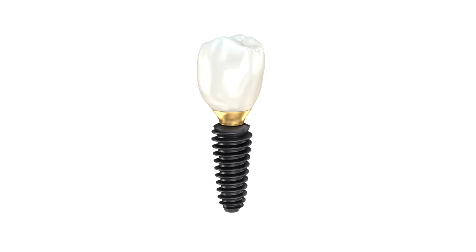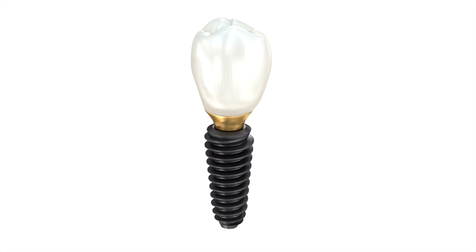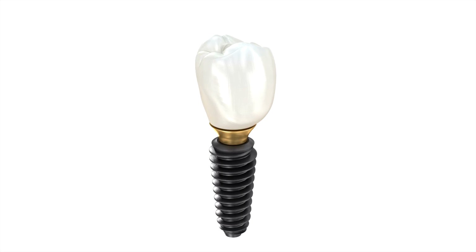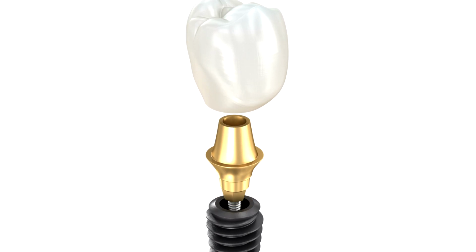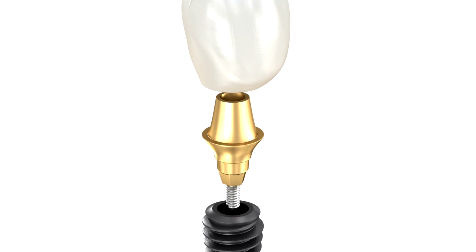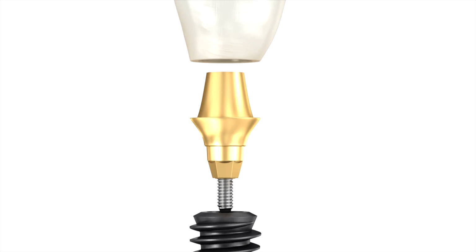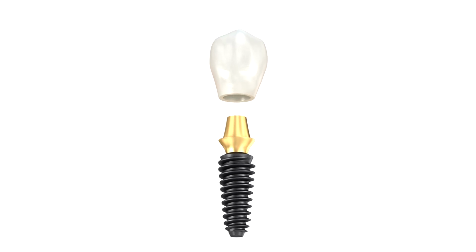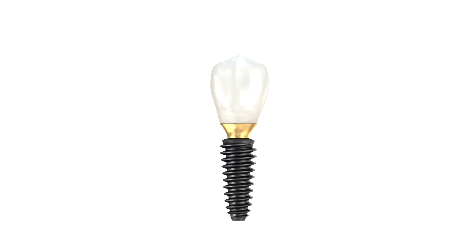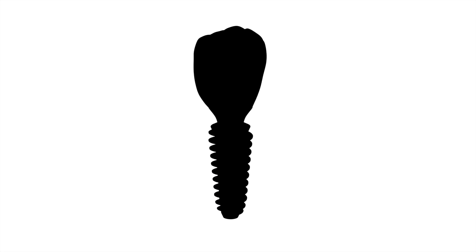We must also consider emerging materials. Zirconia implants have gained traction due to their aesthetic white color and metal-free properties, crucial for patients with thin biotypes or allergies. While highly aesthetic, zirconia is less forgiving mechanically. It lacks ductility and is highly susceptible to low-temperature degradation, or aging. Visual: contrast the mechanical properties.